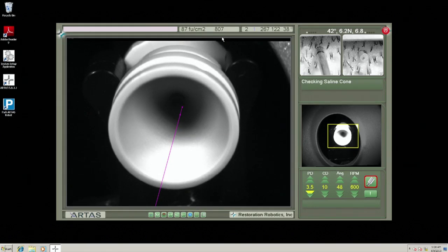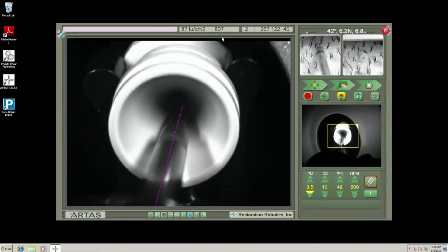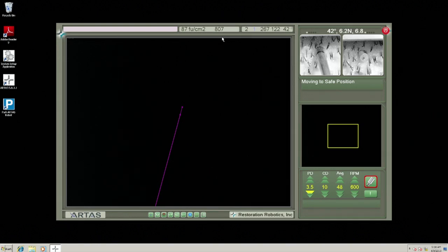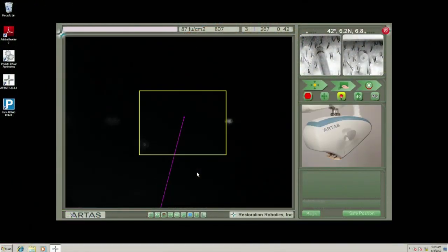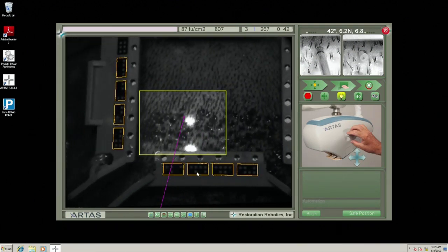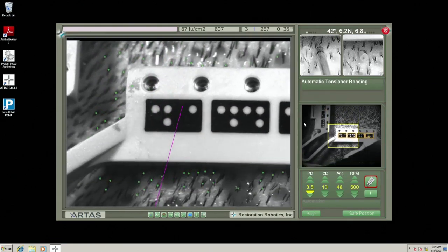Hi, Rakesh. This is Mike Oren with Restoration Robotics. We're working on it. It's certainly something we're looking at, but we currently don't have a timeline for that. Yeah, I'll speak to Mike's discussion too. At the first Artas Summit, we did have a prototype that's taking pictures and creating a 3-dimensional model that allows us to look at the number of hairs that someone could potentially have. It's certainly a beta version. It gives you a computer-generated, very unrealistic looking model, but it acts to provide patients with an operative plan or an idea of how many grafts they would potentially need to get the desired coverage.